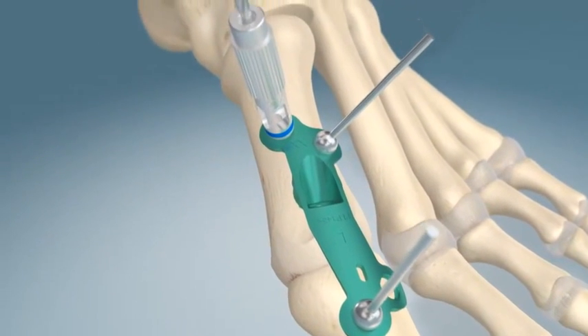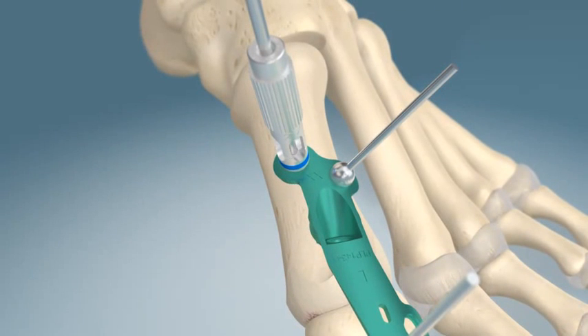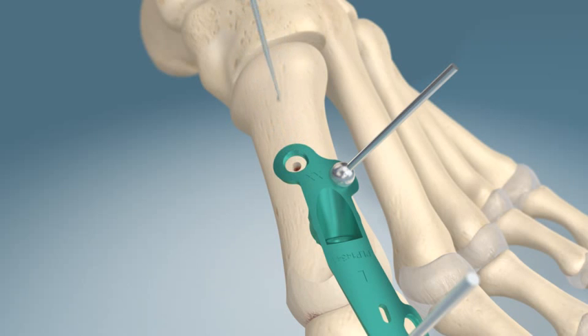Beginning at the most proximal hole, locking drill guides are screwed into the plate to allow for precise screw placement. The proximal holes are reamed and a depth gauge is used to determine screw length. Proximal screws are positioned and locked into the plate.